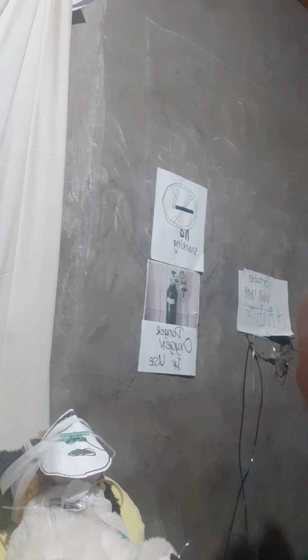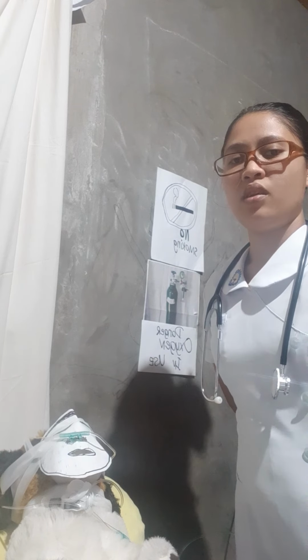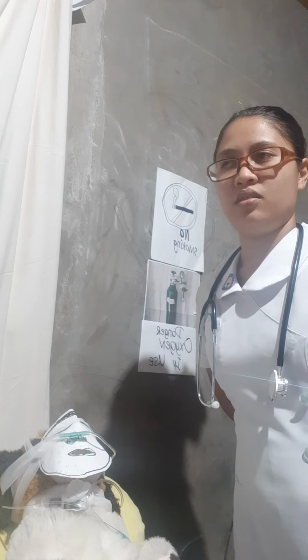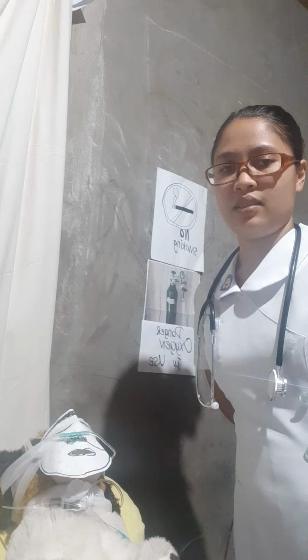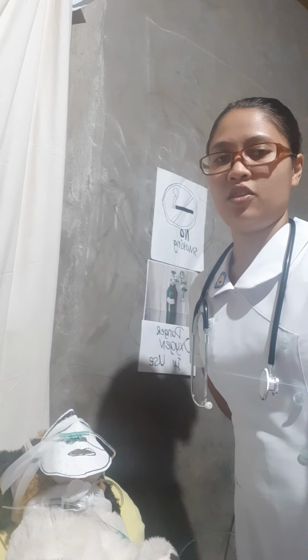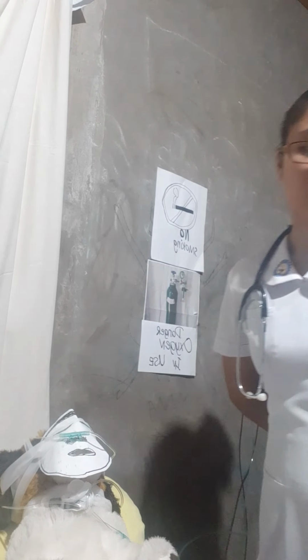And next, for documentation, we need to record the amount of secretion, the consistency, color, and the odor of secretion, size of catheter, and route of suctioning, patient's response towards the procedure. And also we need to document the patient's pre-suctioning and post-suctioning vital signs, cardiopulmonary status, and ventilation measures.